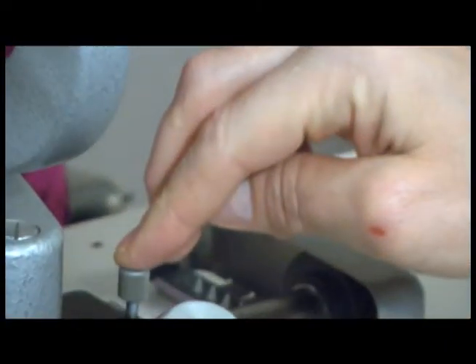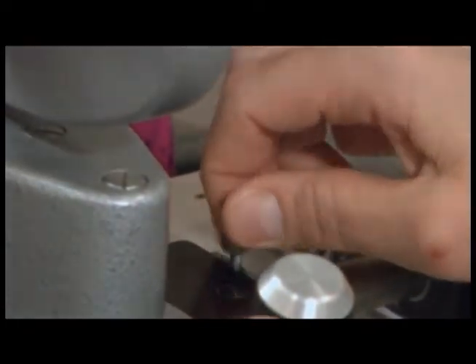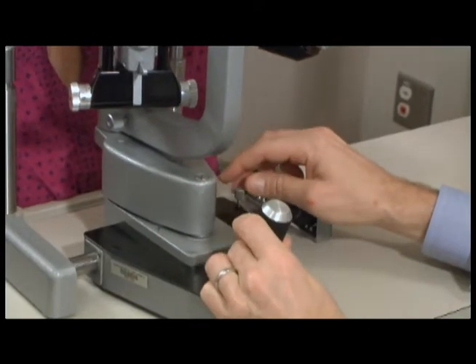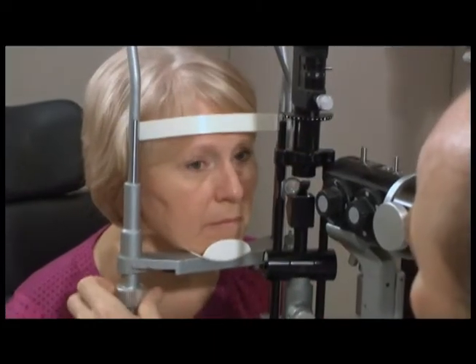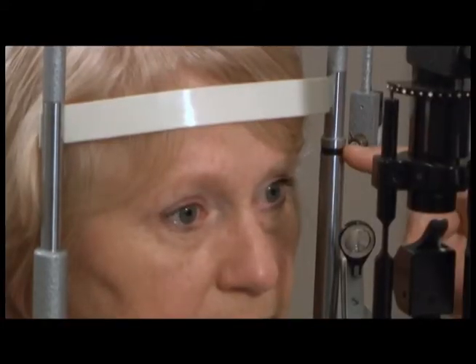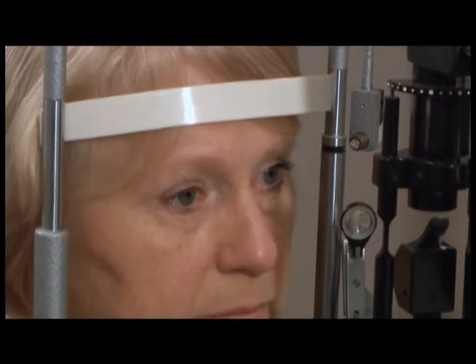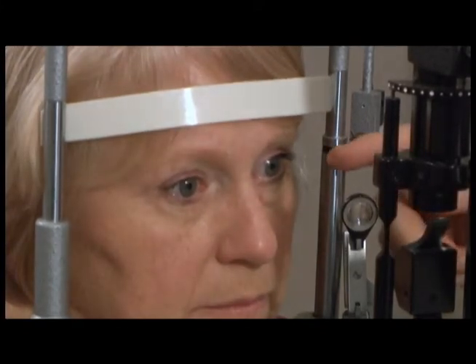The screw on the side will lock or unlock the slit lamp so that it can move. The patient should be adjusted for their height. The knob on the left side of the slit lamp will move the chin rest up or down. The black mark on the side should be in line with the patient's lateral canthus.